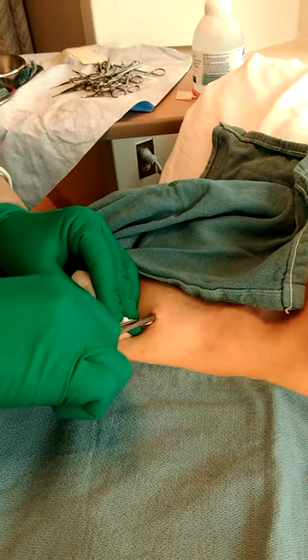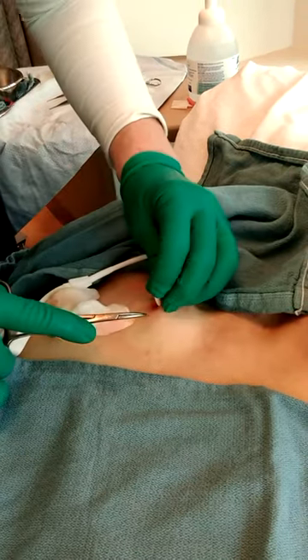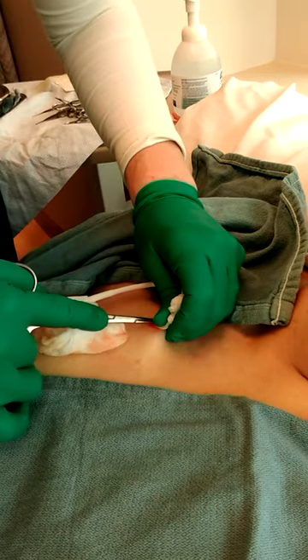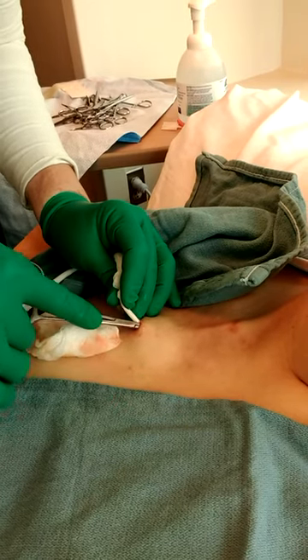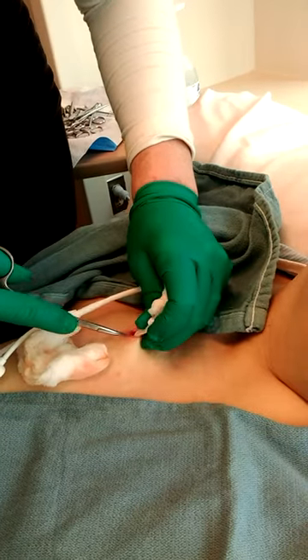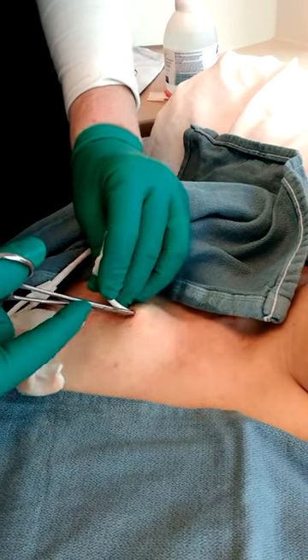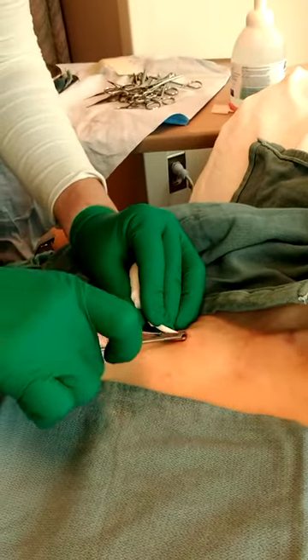There's usually one spot that sticks more than another. Some people have better connective tissue or tighter tissue than other people, so it sticks a little harder. And if they've had another surgery here, you'll get different scar tissue. They don't get stuck in these small instruments — I think they made them for people with really small hands back in the day. Tiny everything. People were tiny back in the day.